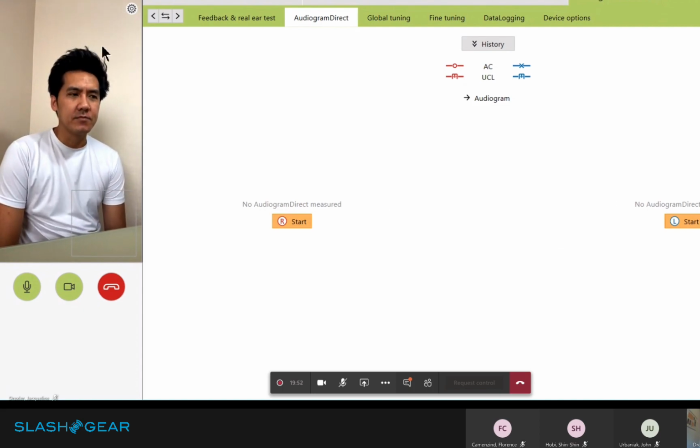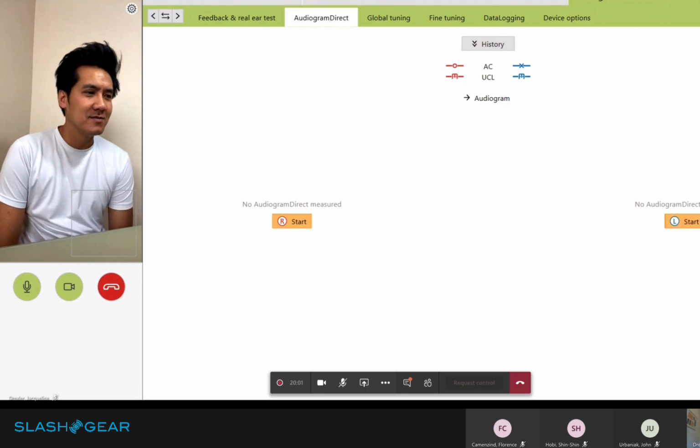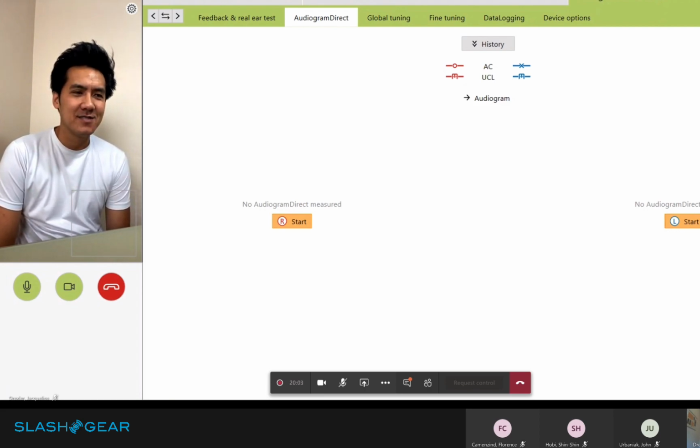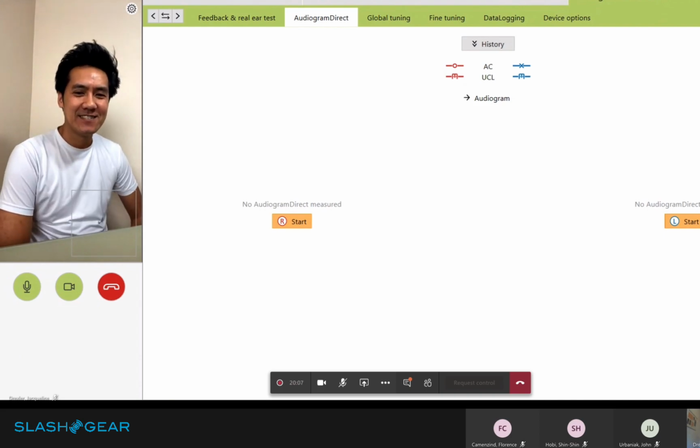Got it. So I'm just going to message, I know nobody can hear what we're saying because we're having a feedback issue. So I'm just going to make sure they understand that's why they have no audio. So we're having a private conversation.